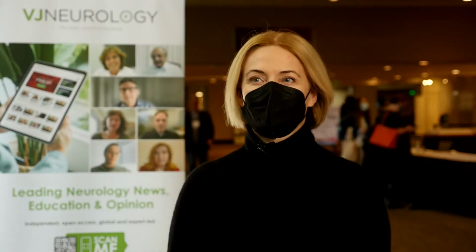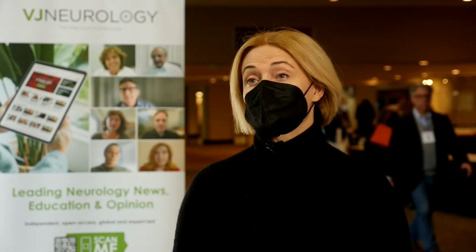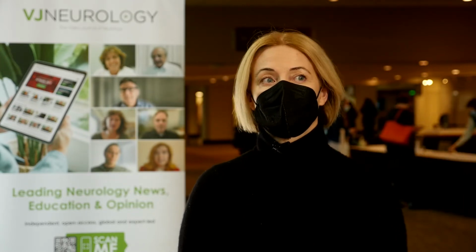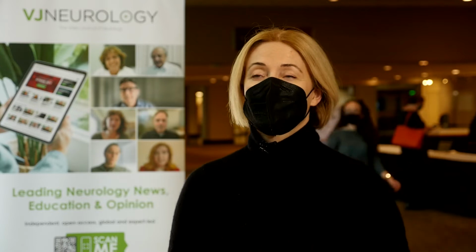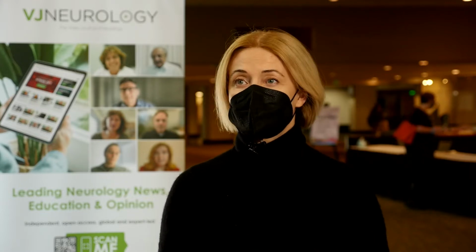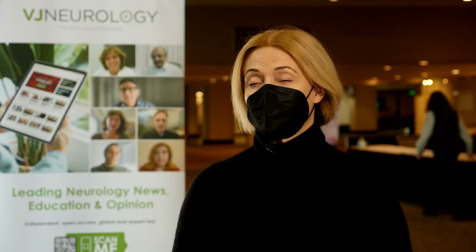Yeah, in the last years, the use of neuromodulation has been widely increased, but on an exploratory basis, not only to improve cognitive function, but also to improve other symptoms like fatigue or spasticity. But in recent years, from success and failures, we found out that the best combination of using these tools is with training, whether it is cognitive training or exercise or rehabilitation, because both interventions work on the mechanisms of plasticity, so there could be a synergistic effect on that.